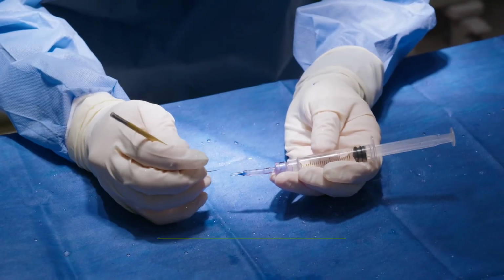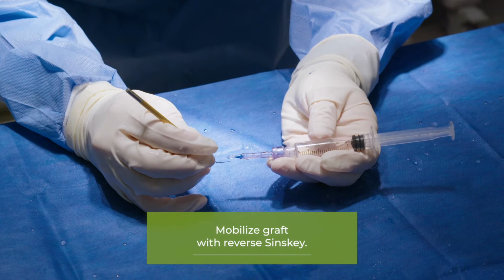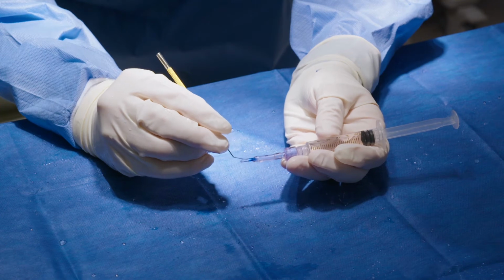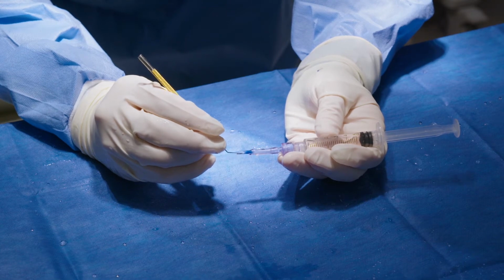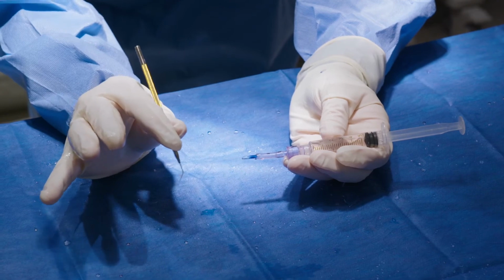So this would be under the microscope, which would make this a lot easier. But I would basically go in with the graft bevel up, because when I'm bevel up, I know that the folds are below, and I know that we have the tissue up here where I can grab onto. So I go up here and I gently grab the edge and I just pull it about 1 millimeter, and that kind of breaks any sort of suction that could be present.